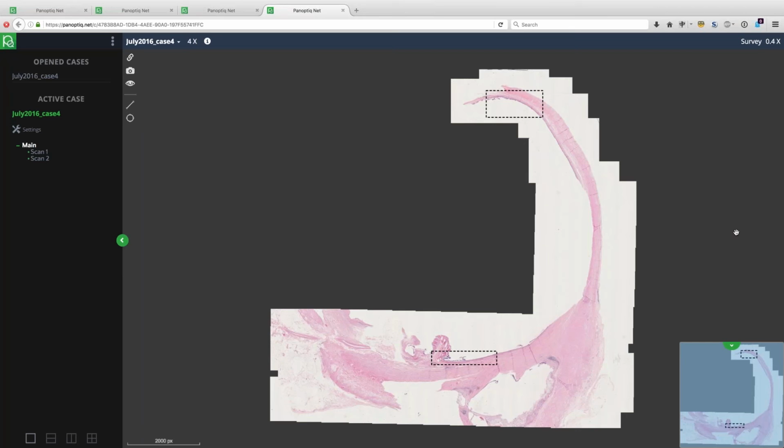It was pretty much dilated, as you can see in this image, with thinned out walls and mucin and a little bit of epithelial proliferation lining the lumen. There was no way I could have shown this immense dilatation and thinning of the wall using a still image, at least not this effectively. Can you go to one of those boxes, Richard?